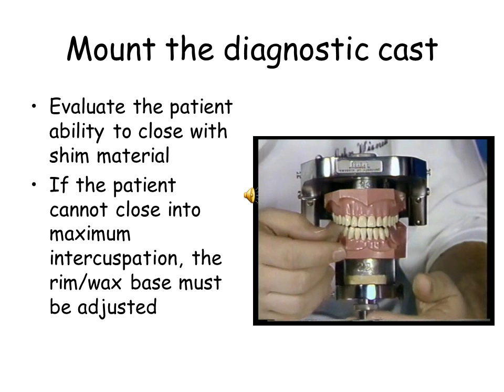Complete closure of the mandible against the maxilla must be achieved. This may be verified using a paper shim from your articulating paper or visual inspection to ensure that the teeth are completely closed. If they do not completely close, adjust the wax rim.